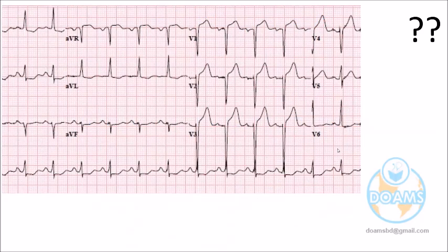Now you are mature enough. Can you say, looking at the P wave and QRS, what abnormality are you getting? I cannot enlarge that much. This is the ECG. Can anybody say any observation anywhere? So try to start from the rhythm strip first and come to other areas.